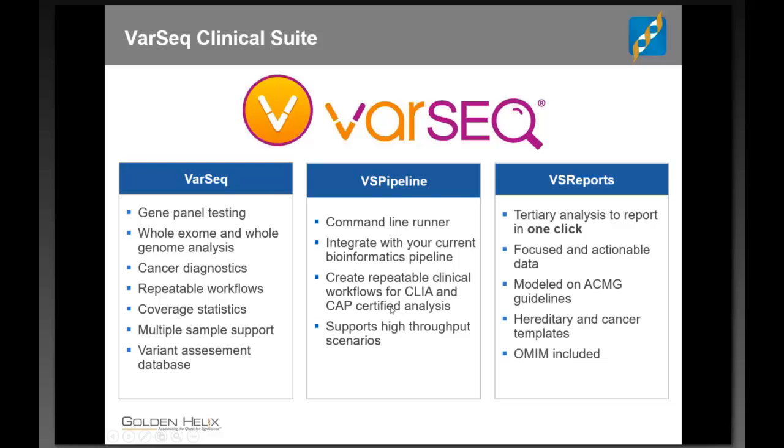So that's sort of at the very beginning, linking it to your sequencer, and at the very end, linking it to your downstream is this new tool we're launching today, VS Reports, that essentially with one click gets you that final report that integrates all of that tertiary analysis. And we're modeled off of ACMG guidelines. This can be set up to handle hereditary tests and cancer tests, etc. And another thing we'll mention going forward is that we've also integrated OMIM as bundled with VS Reports, and this is up-to-date monthly snapshots of this critical database of genotype and phenotype associations and all the literature and references, rich information you get there.